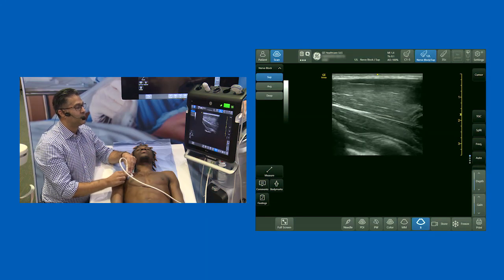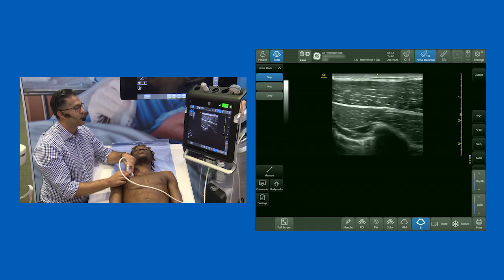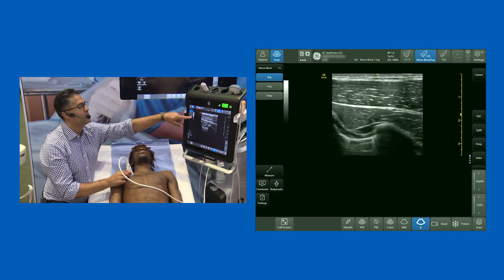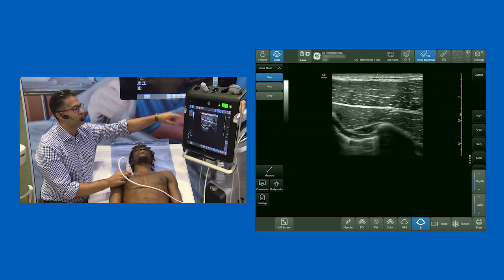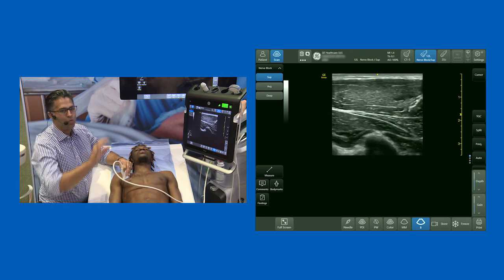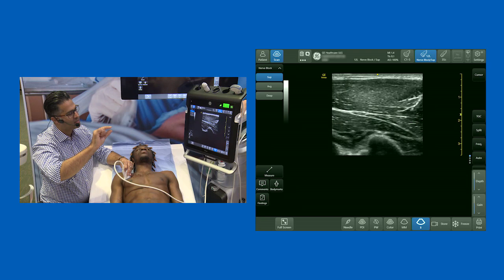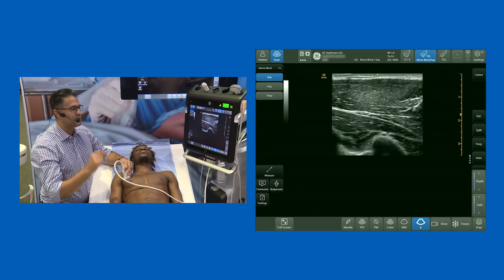If you wanted to do a PEC 2 block, the first part is to inject a local anesthetic between PEC major and PEC minor in that plane. Obviously don't go into the vessel, but you inject in proximity to that vessel in short axis — you will get the lateral pectoral nerve. If you slide the probe laterally, you get that wonderful view of the PEC minor ending, and you want to inject local anesthetic in that plane between PEC minor and serratus.